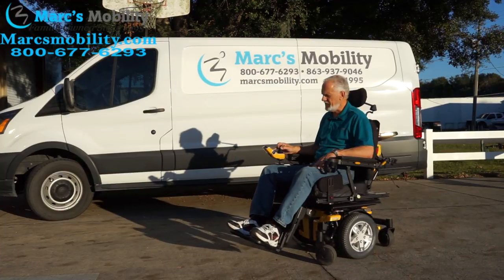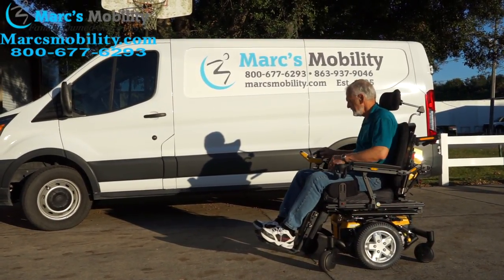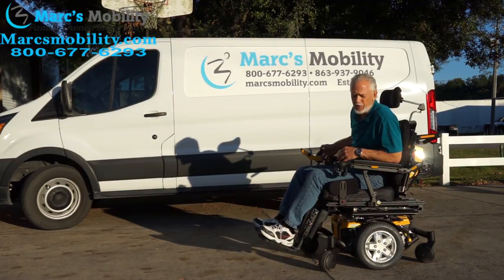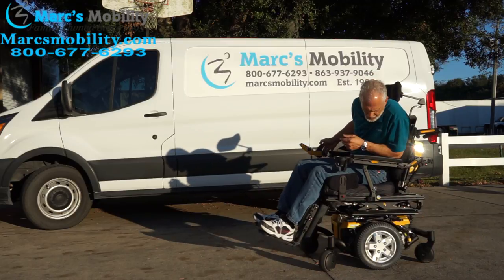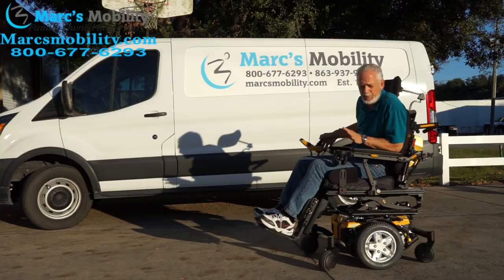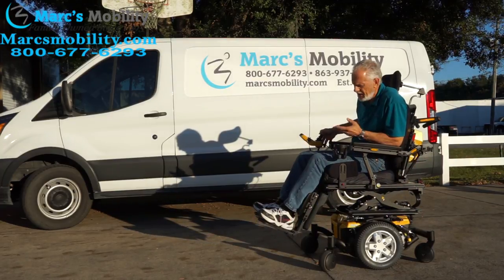Now I'm going to elevate the seat so you can see it going up as we're talking, and then I'm going to drive with the seat elevated in a few seconds. This is the Quantum Edge HD — 400 pound capability — it has the seat lift of 10 inches, the tilt, the recline, and the electric legs.